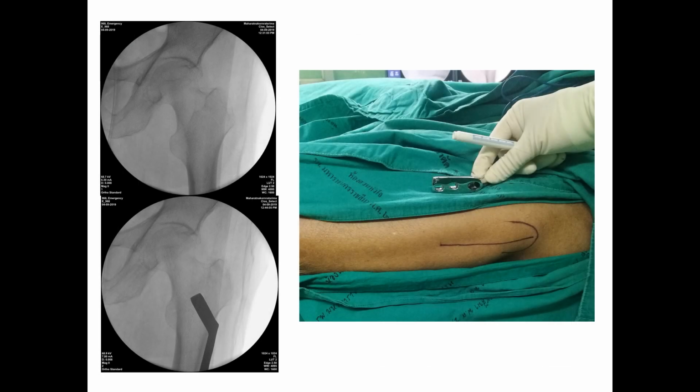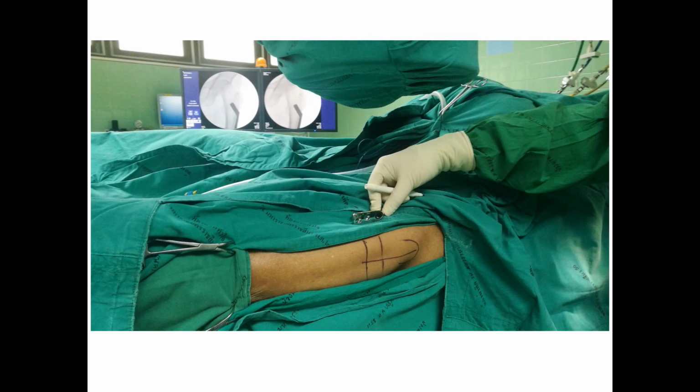After adequate analgesia, the patient was set in supine position on the fracture table. The fracture was reduced and alignment was checked with fluoroscope. The 2-hole side plate was placed over the proximal thigh, then we used fluoroscope to demonstrate the planned position superimposed on the proximal femur. And the skin was marked in the same area of the screw hole, 3 to 5 cm in length. This picture is showing skin marking.